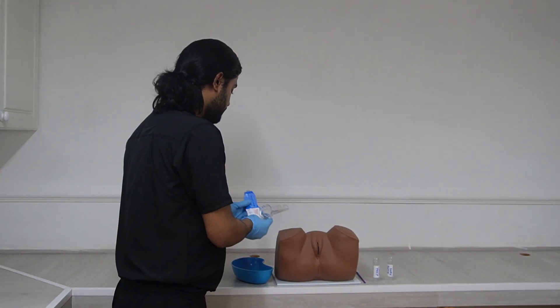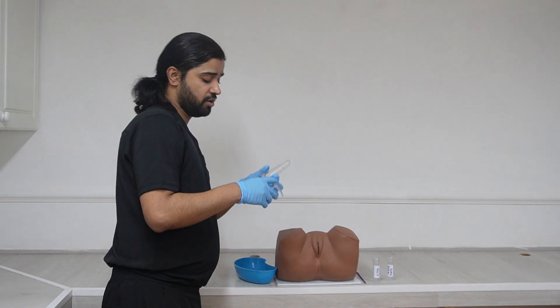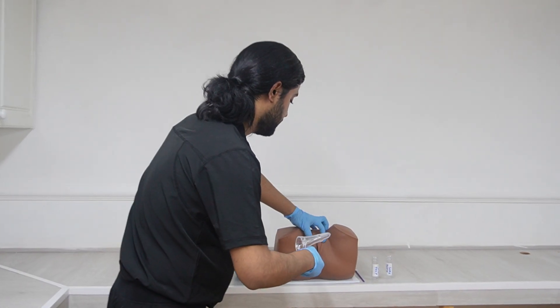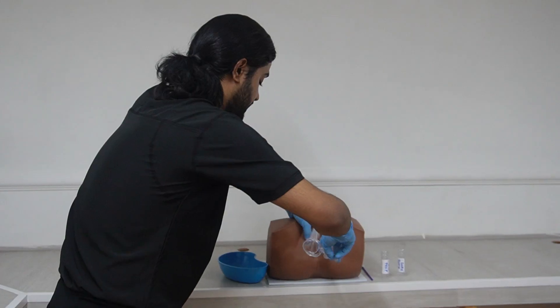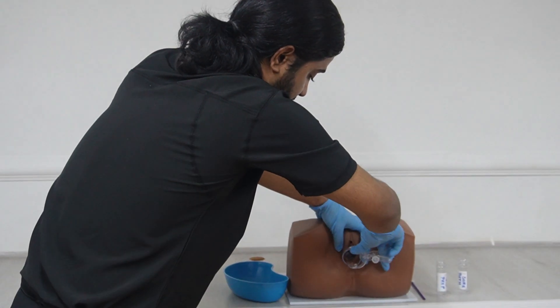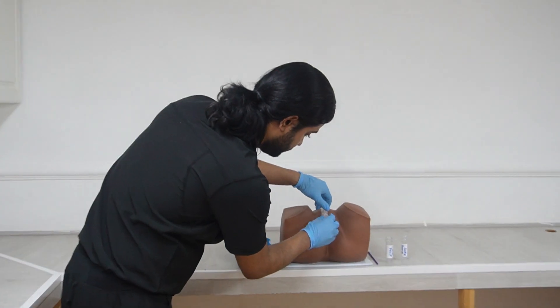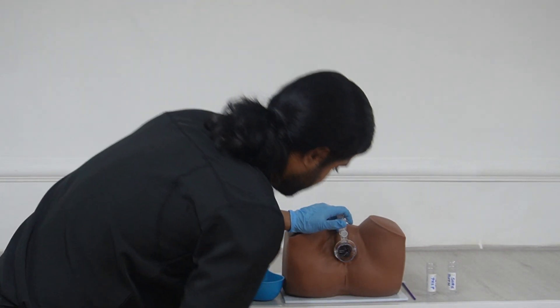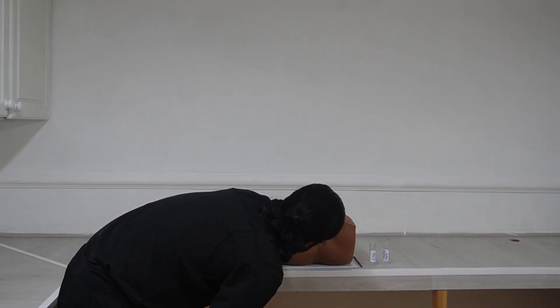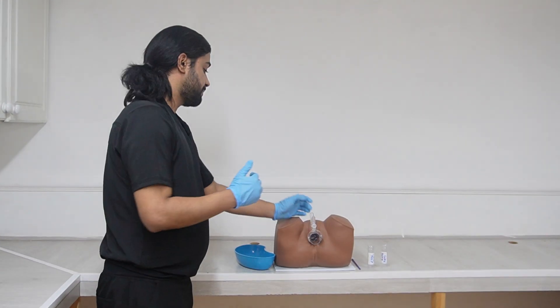Apply gel on both sides of the blades and let her know you are going to insert. Hold it as described. Part the labia with your non-dominant hand and insert with the speculum in the 3 o'clock position. Insert it fully, then rotate to the 12 o'clock position. After that, open the blades and tighten the nut, then look inside with a light source for any cervical ectropion, vaginal discharge, cervical masses, or any abnormality.